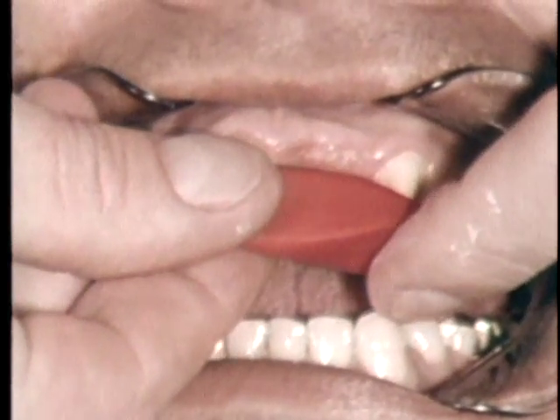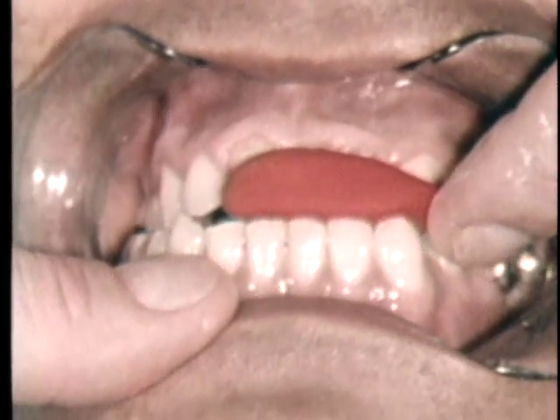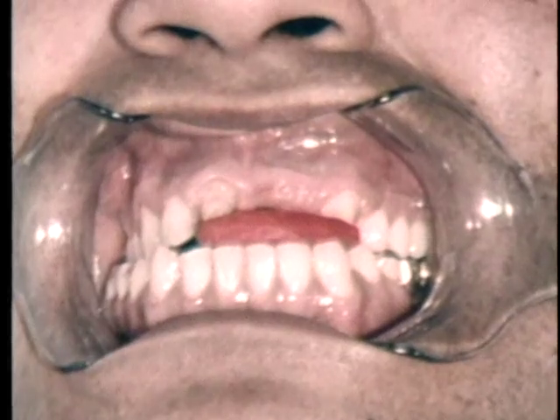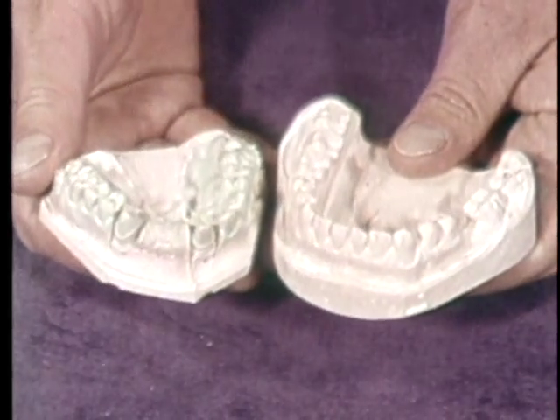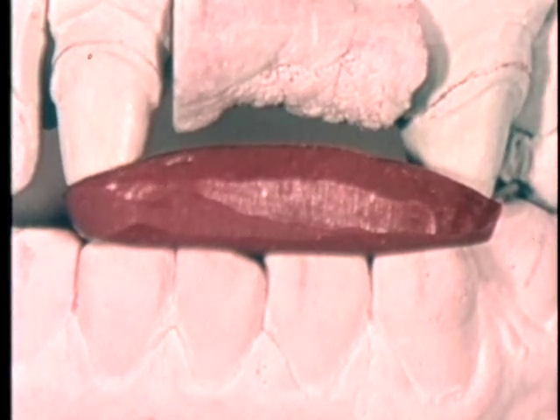Once again, the tissues are dried, lubricated, and the wafer positioned over both abutments. Upon removal, it is trimmed and returned to the mouth for verification. The casts are checked for seating interferences prior to articulation. The trimmed wafer must show only the incisal edges of the preparation. Excessive coverage by the recording can cause fracture of fragile anterior dies.